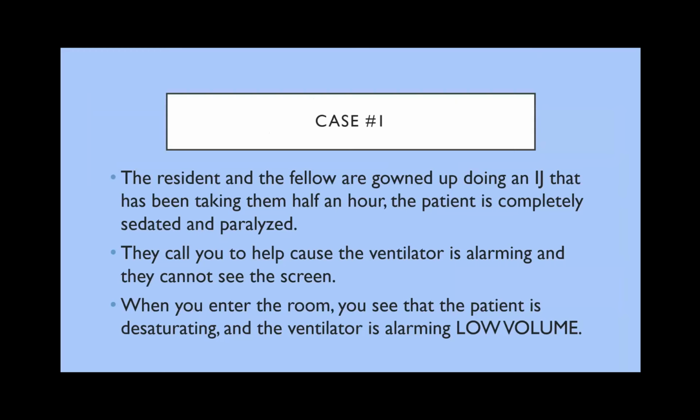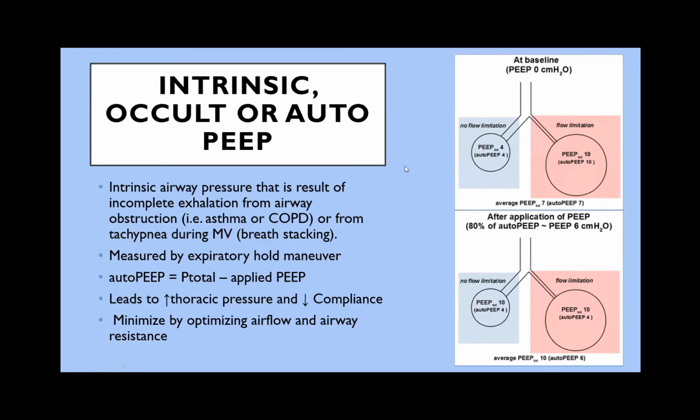Okay, so before we move to cases, any questions? Hi, Bertin. Yeah, I have a question. What do you mean about disconnecting the patient, in what way? So you don't remove the endotracheal tube. What you remove is the connection of the ventilator to the endotracheal tube. So you allow the positive pressure to create a gradient with the atmosphere and leave the lungs.